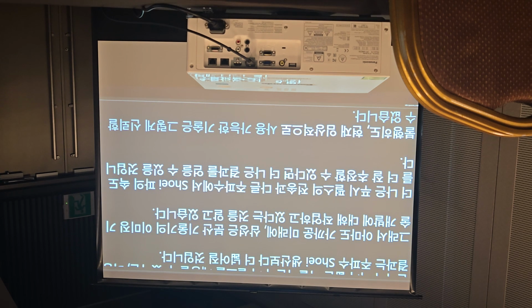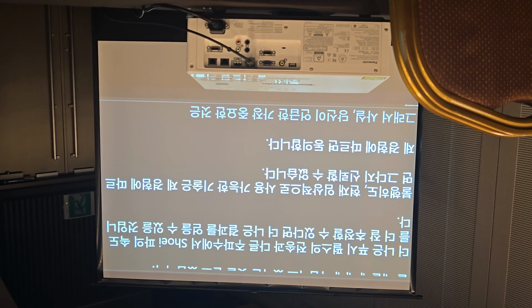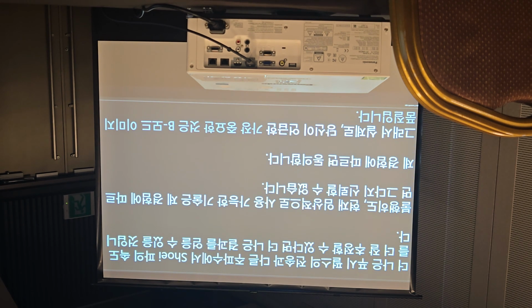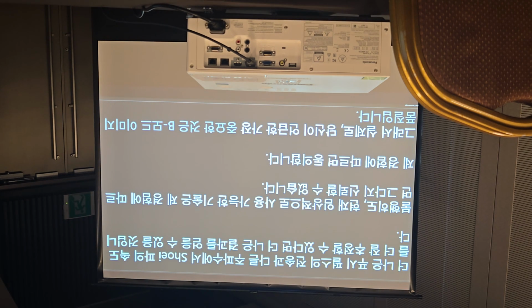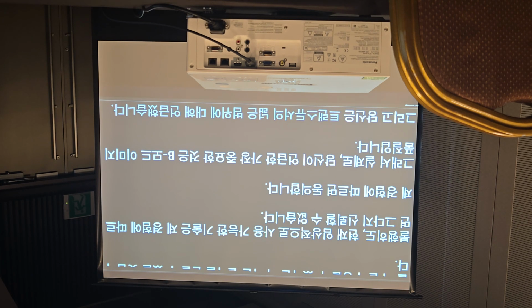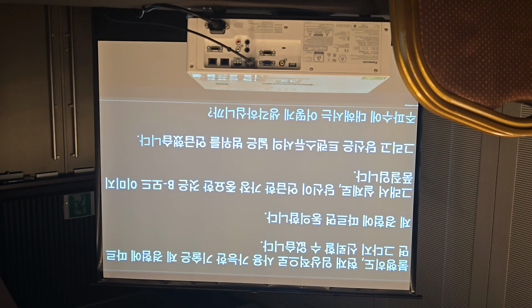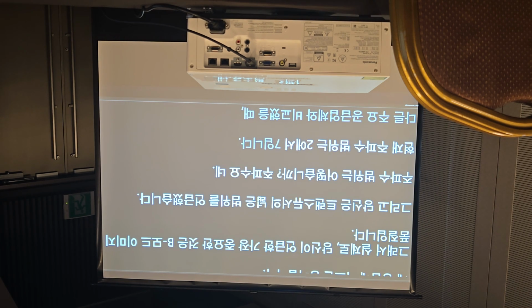I agree. So actually, you mentioned the most important thing is B-mode image quality. And you mentioned the wide range of transducers. What about the frequency range? So frequency, yes. As of now, the frequency range is 2 to 7. Compared to other major vendors, maybe it's not the widest one.